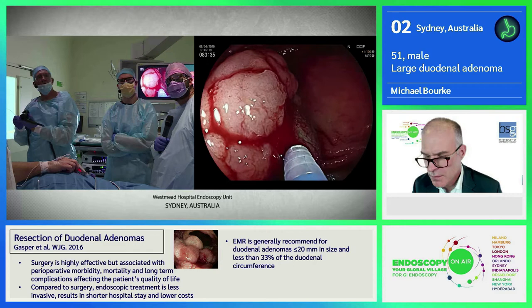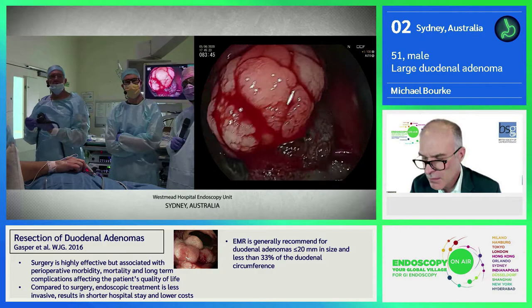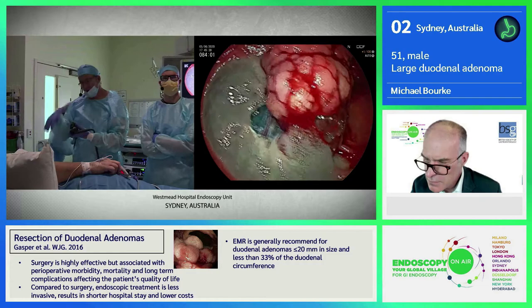Have you ever retroflexed, Michael, in the duodenum with a gastroscope? Yeah, we do, needle back. This sort of duodenum would be very easy to retroflex in to look, not with this scope, but with a gastroscope, to look at the D1, D2 junction from underneath. And it's an invaluable technique to do resection around that area. You get a much better view. You get the forward view and then you get the retroflex view. Open things.